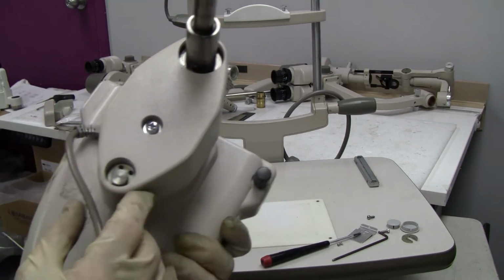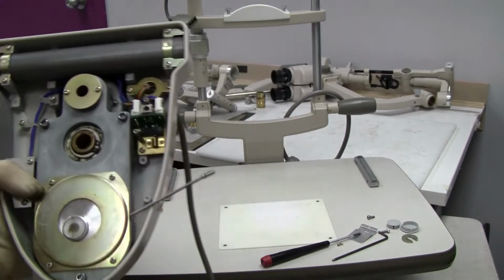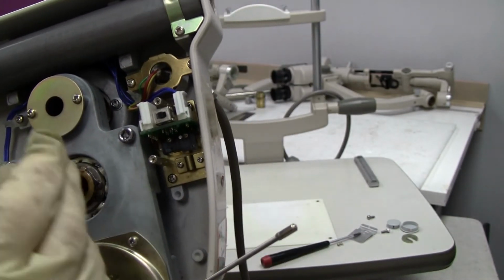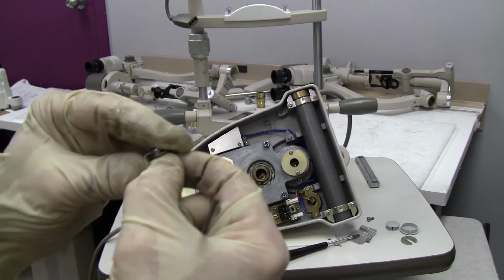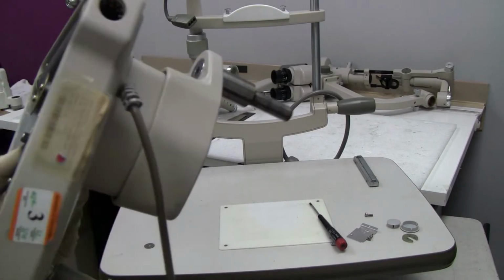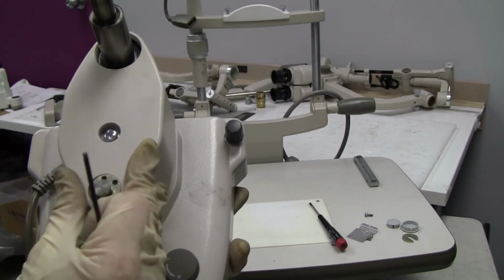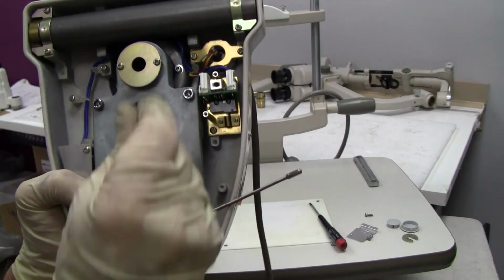Now, before we take this off, we're going to want to loosen this Allen in here. This is like the safety stop. Once you've taken this little washer and 2.5 millimeter screw off, then we can go ahead and take our half moon washer off so that we can continue on and taking off our base.